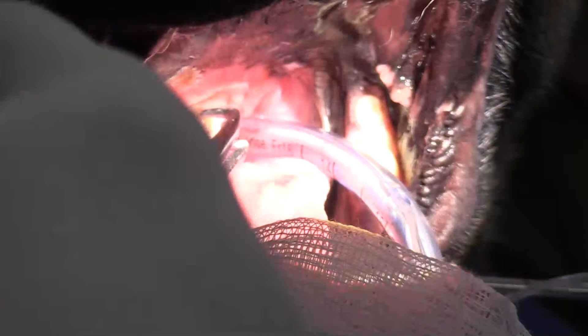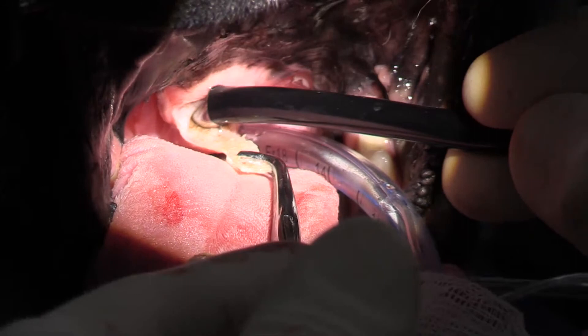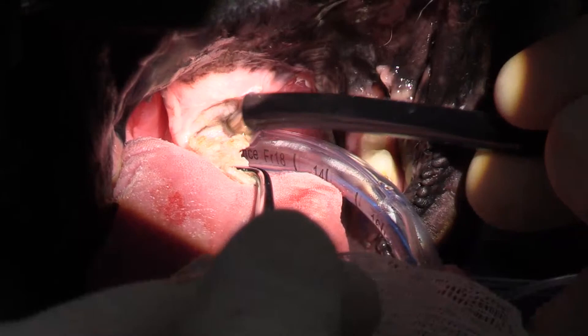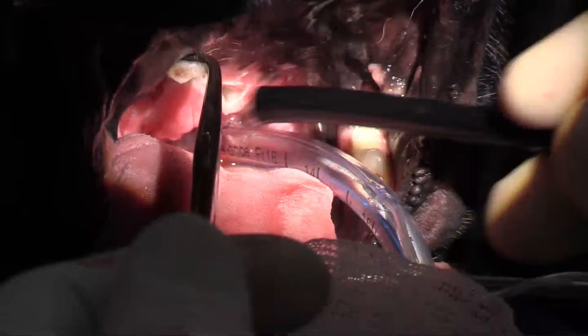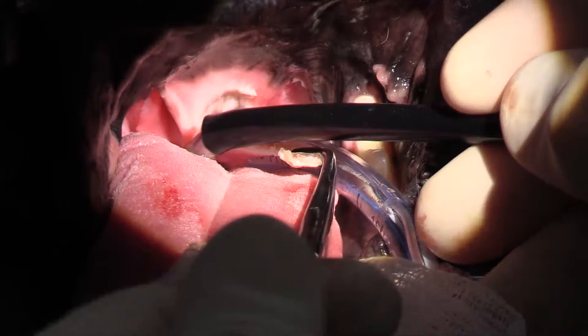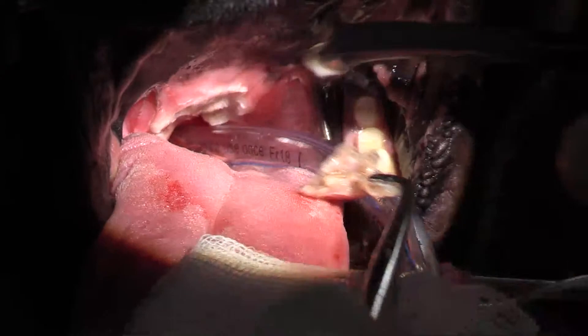It has bipolar electrocautery built in as well, so you're going to have less swelling than with conventional cautery. It also has suction built in, so all the fluid accumulating around the airway I can either cauterize or suction out. It's almost a blood-free surgery field.